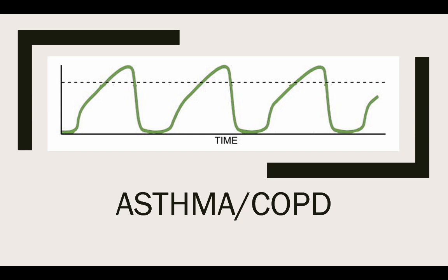They're trying to force out this air. That's their issue. They can breathe in just fine. So this inspiratory wave, this inspiratory angle, this beta angle, is just fine. But then they've got almost no alpha angle. And they're trying to push this out. And because of that, they are trapping CO2.